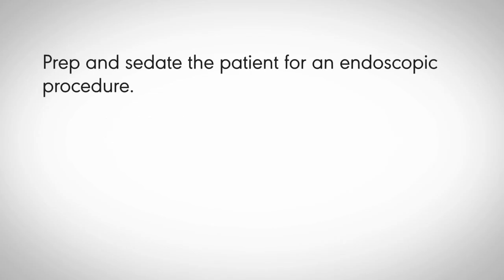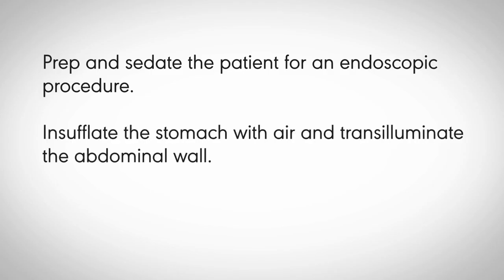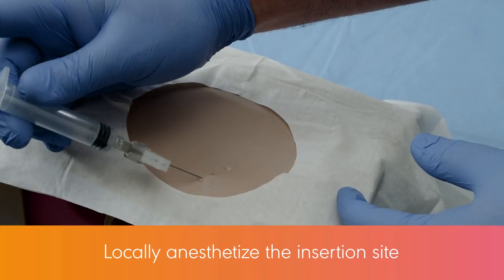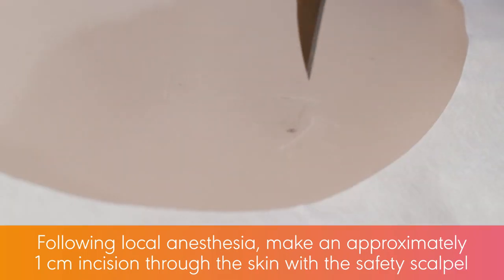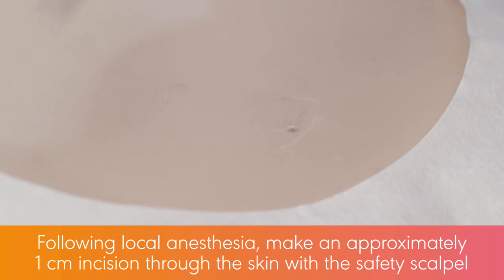Prep and sedate the patient for an endoscopic procedure. Insufflate the stomach with air and transilluminate the abdominal wall. Select the gastrostomy site. Prep and drape the skin at the selected insertion site. Locally anesthetize the insertion site. Following local anesthesia, make an approximately 1 centimeter incision through the skin with a safety scalpel.